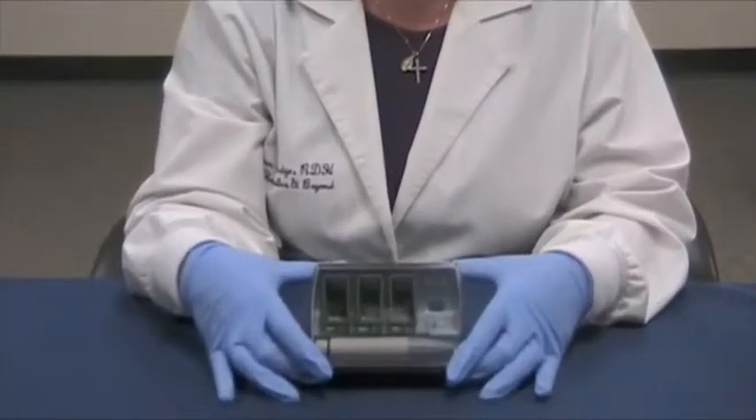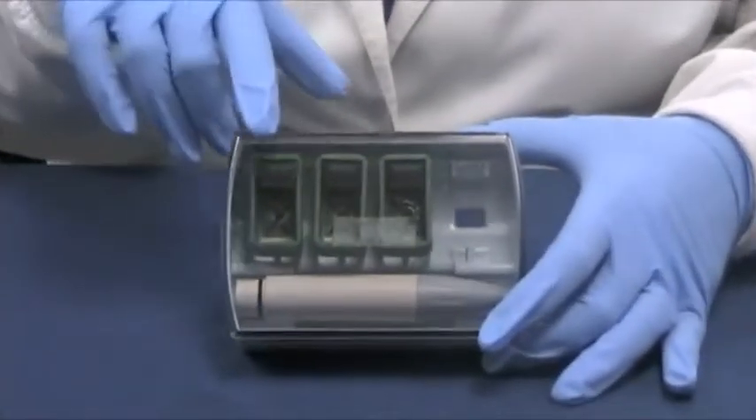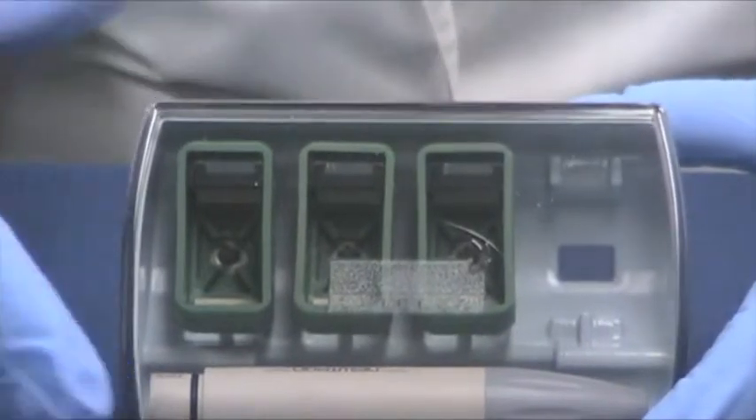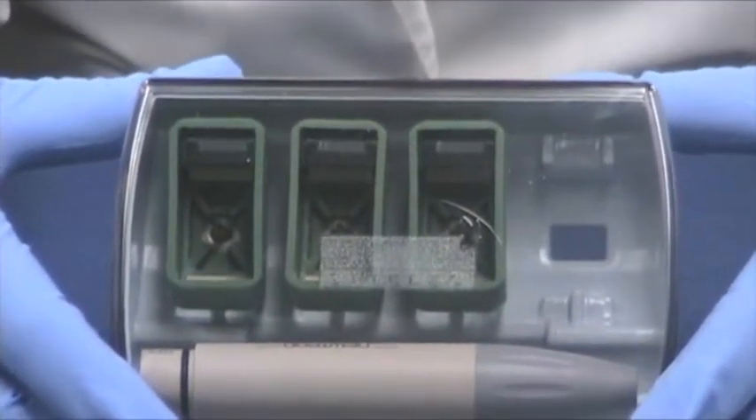Hi, Colleen Rutledge here again. Now we're going to talk about the Diamond Perio Kit. The Diamond Perio Kit consists of three tips: the H1, the H2L, and the H2R. All are used on the green mode or the low power setting.